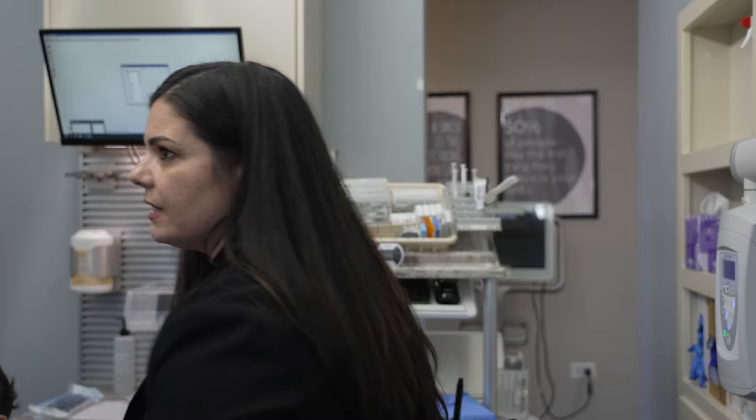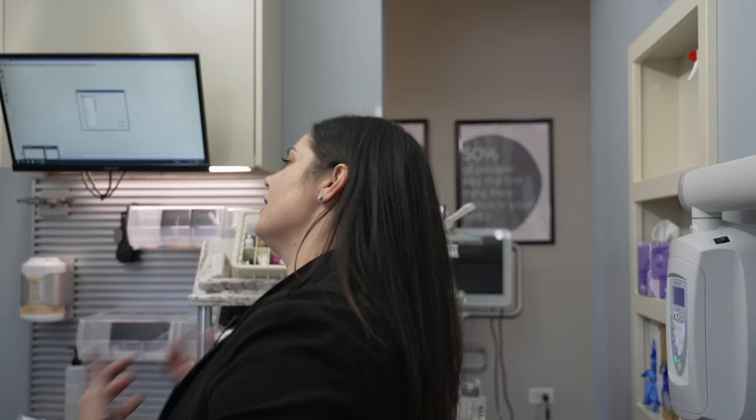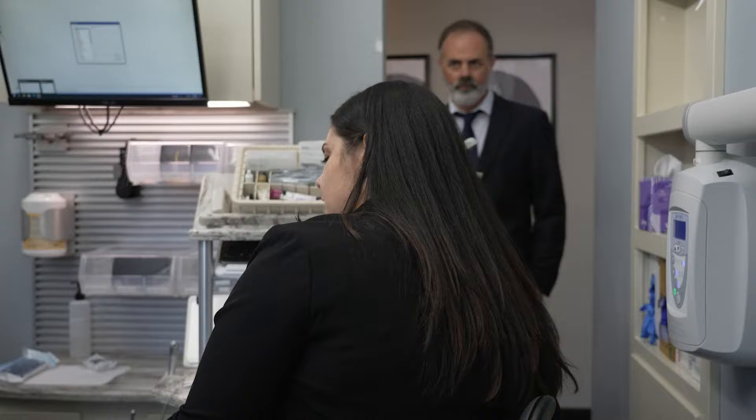We thought that was an important feature. If room depth was an issue, or if you had somebody really tall, you can scoot that patient on back. Or if you're tired of saying 'come up, come up,' just push them over to you. Or depending on the provider, they might need a little bit more space. The traverse feature is awesome. When you're practicing, this is kind of your go-to position.